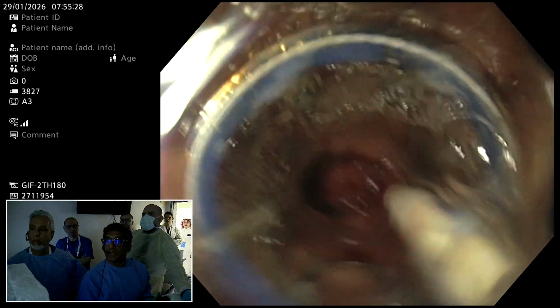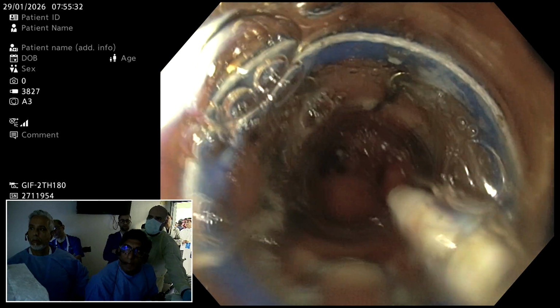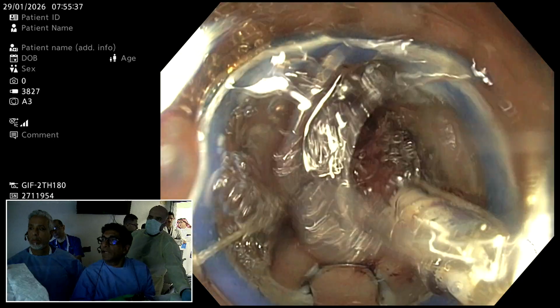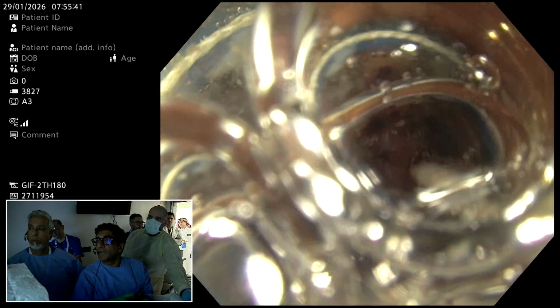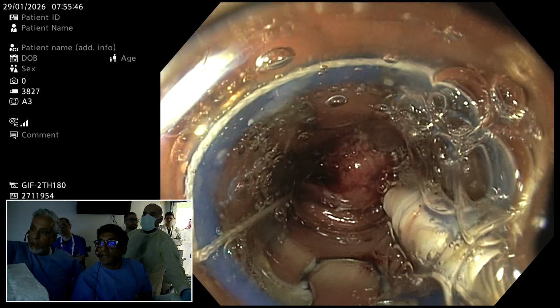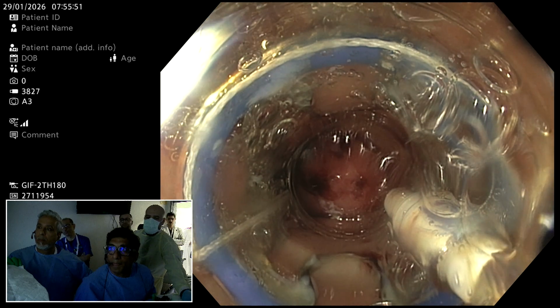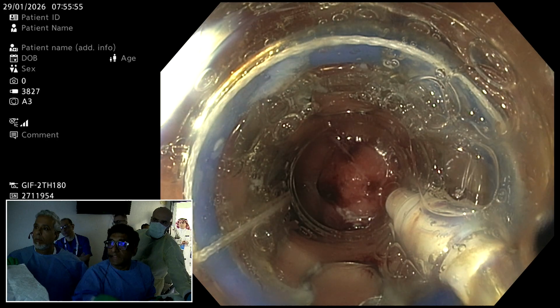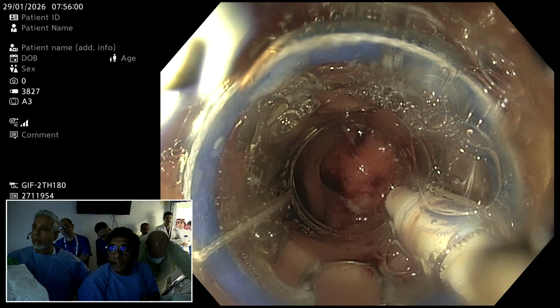to bring this into the cap. So I must go inside the duodenal pylorus, and then enface it and do gentle suction so that I can see the mark. You can see the mark, yes? Yes, absolutely. You can see it right at the rim of the cap here. So that's the mark. I have two types of mark: one on the distal, anal side, and one on this side, the oral side.